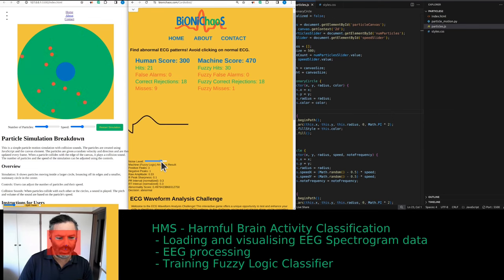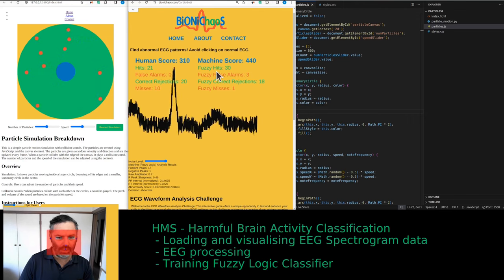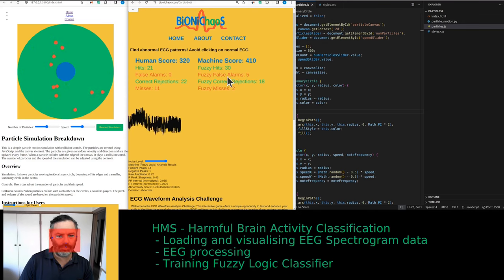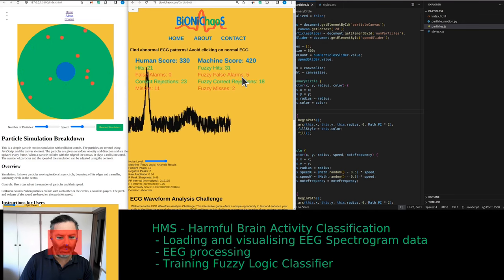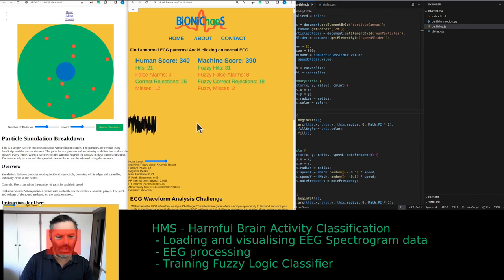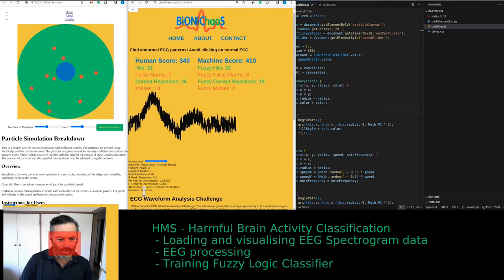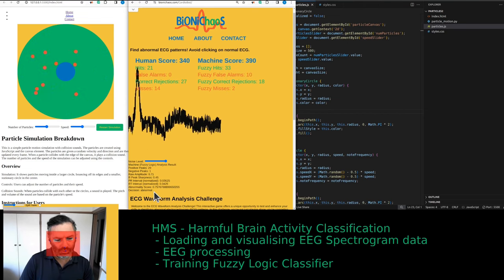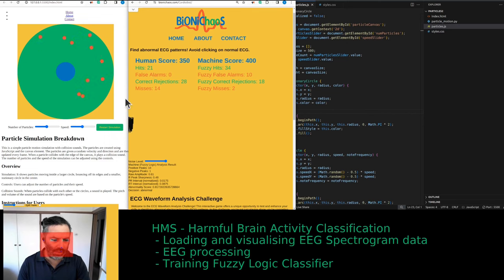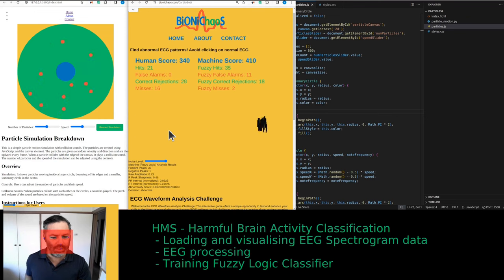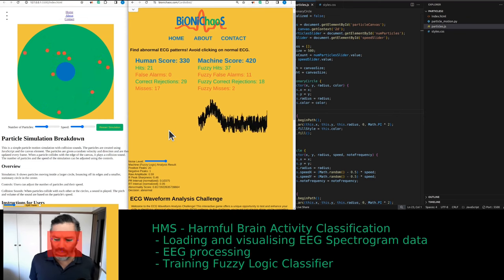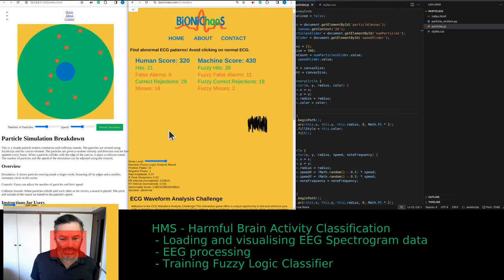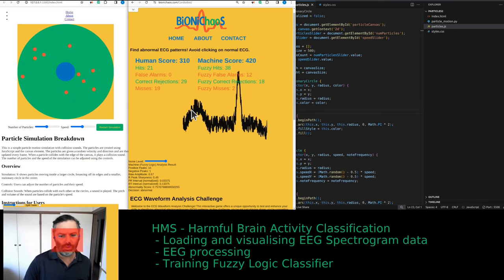When we send the noise all the way up, it will start making mistakes. The false alarm rate will go up — it keeps false alarming, essentially labeling everything as abnormal. You can try to fix the algorithm, but it's actually good for you to see what happens with increased noise.